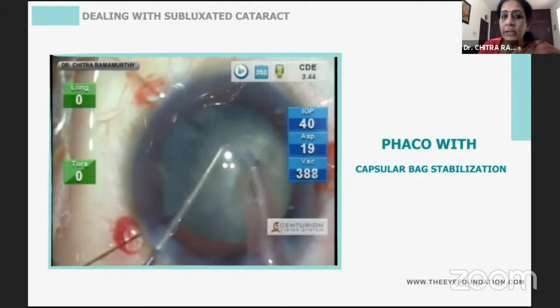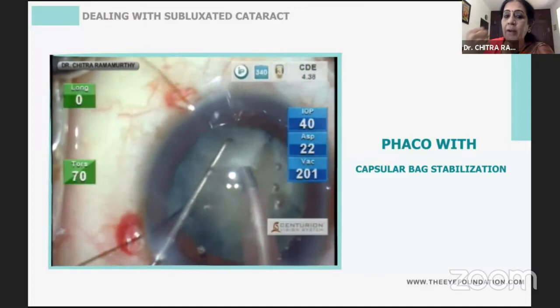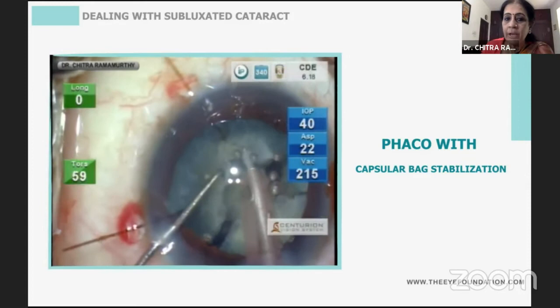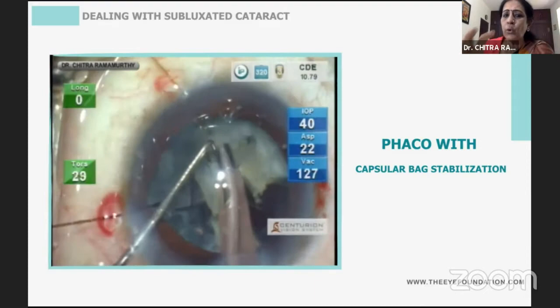One major advantage is that as long as the nuclear fragments are there, they keep the posterior capsule well away, because it's a lax capsule that can otherwise trampoline into the phaco probe. While the pieces are there, you're actually better off as long as you do not stress the capsular bag, inject enough viscoelastic, and do not shallow your anterior chamber. And then when you go on to get your first fragment, you ensure that you get the right purchase of the nuclear fragment, bring it immediately into the supracapsular space, and try not to do too much work within the capsular bag. And even early on, you could do it.